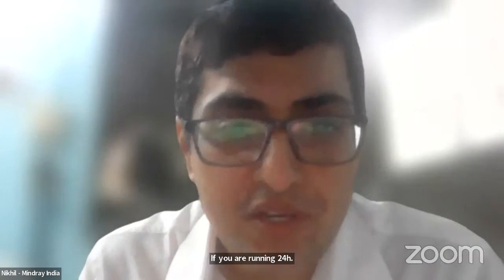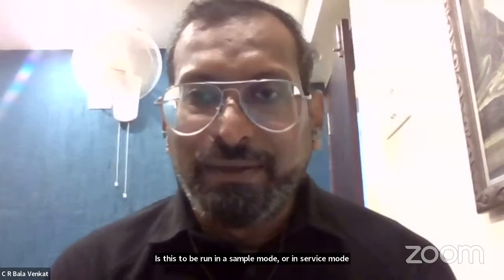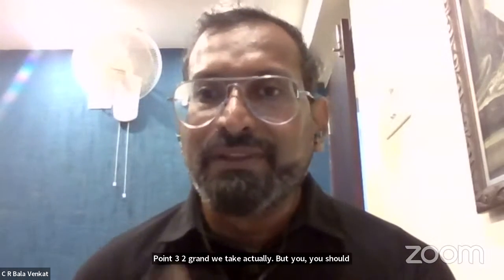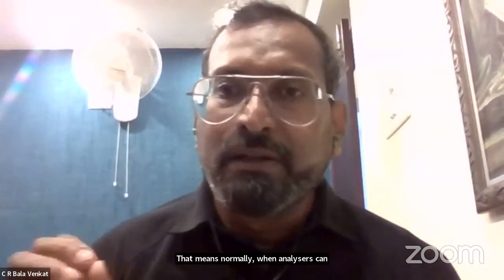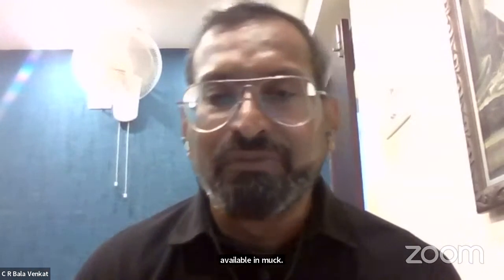Yeah, Bala. One more question related to your explanation earlier. What is the concentration of potassium dichromate? Is this to be run in sample mode or in service mode? No, we have a procedure. I just mentioned the content, but it is 0.32 gram we take. But you should have traceability of that. This is potassium dichromate with 8 absorbance. Normally analyzers can read only 3 absorbance, but this material is 8 absorbance, which is available from Merck. Maybe we can try.